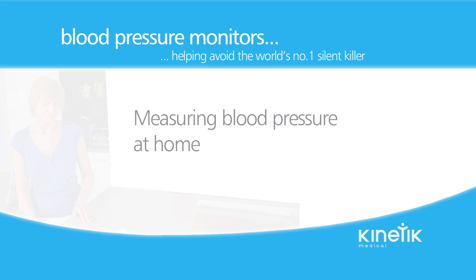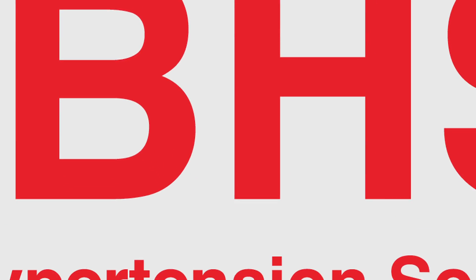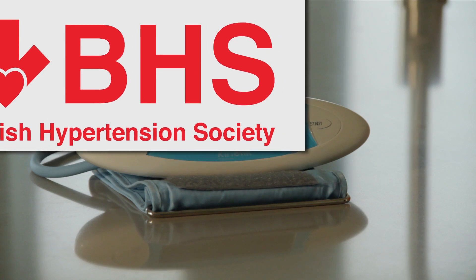If you are taking your own blood pressure at home without the aid of another person, the Kinetic Blood Pressure Monitor offers practicality, accuracy, and is the first ever blood pressure monitor to be tested and approved by the British Hypertension Society.